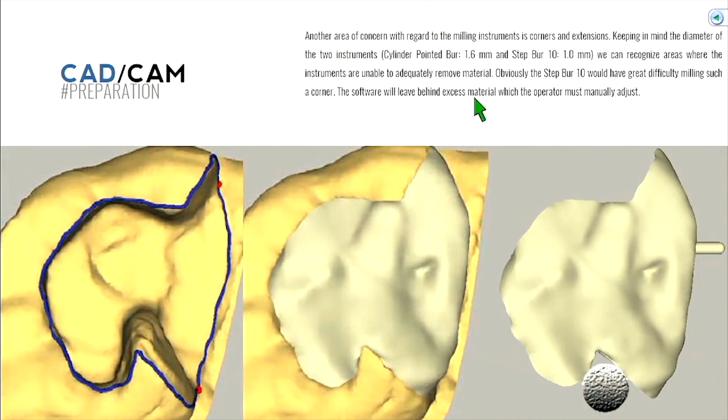All right, a couple other principles. This is a different application. We're going to learn about inlays and onlays when you guys get back after you do operative 2 and endo. So this will come in mid-October. But I want to show this principle here. And very similar in the sense that if you have any sharp transitions, again, your burr isn't going to mill that sharp angle there.